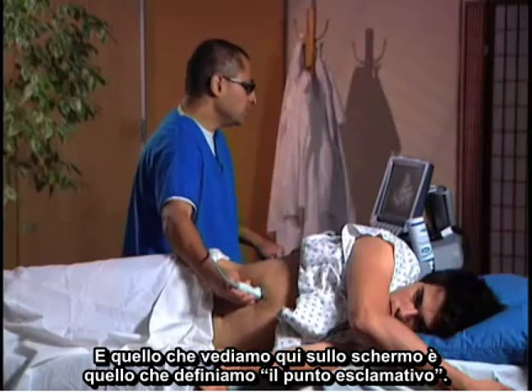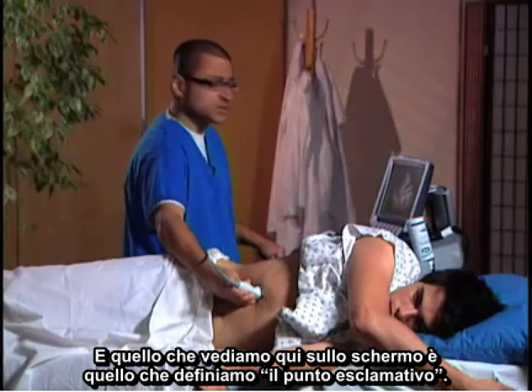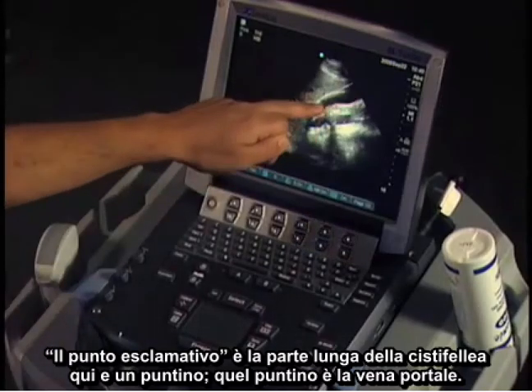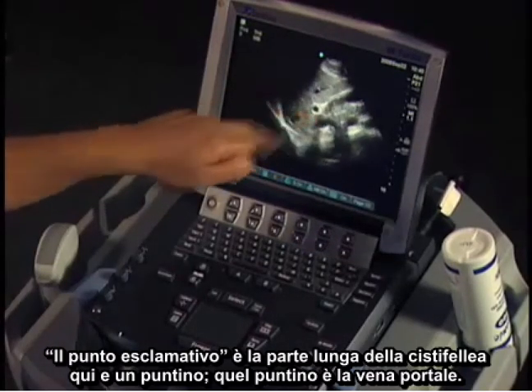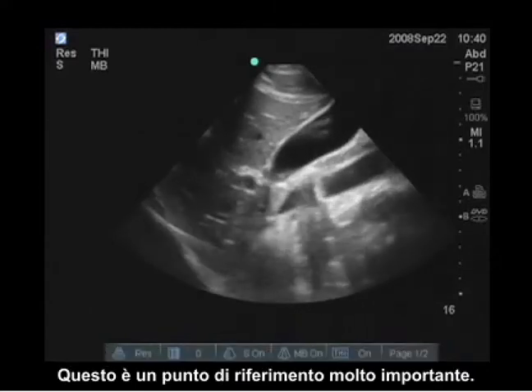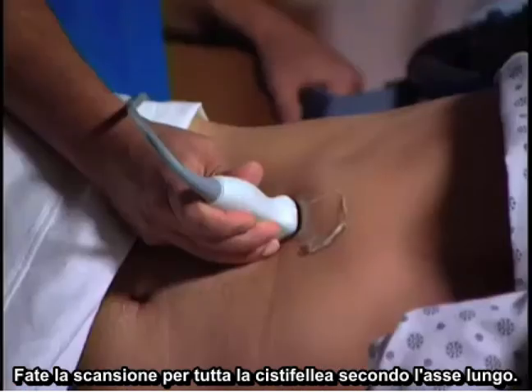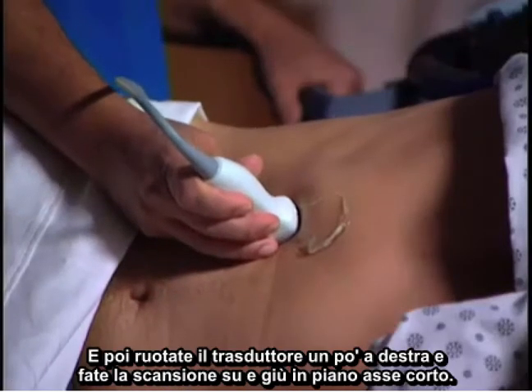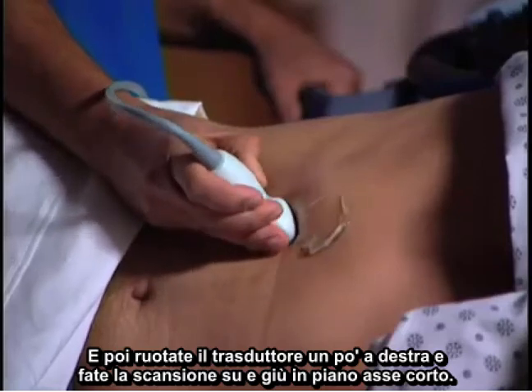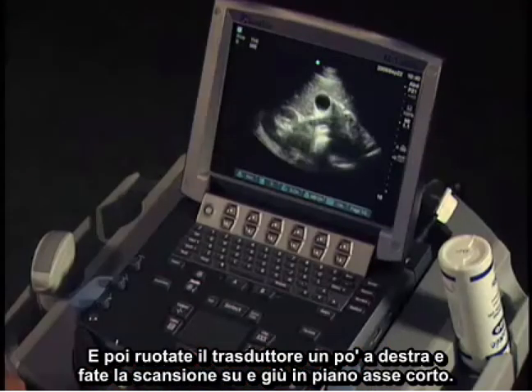What we see here on the screen is what we term the exclamation sign. The exclamation sign is the long part of the gallbladder and a dot, and that dot is the portal vein. Together that is a very important landmark. I'll be scanning through the entire gallbladder in a long axis fashion and then I'll turn the transducer just a little bit to the right and start scanning up to down in a short axis plane.